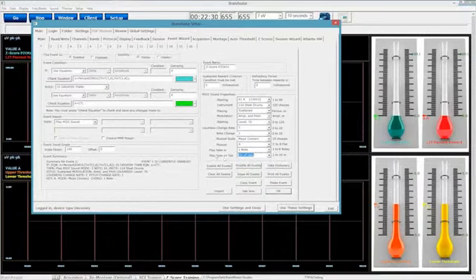Now, I'm not the best really when it comes down to getting sounds out here. There are a couple people out there who are excellent for this. Tom Brownback of Brownback Mason is remarkable with what sounds are best to choose, and Mark Smith is also very, very good at it. Another great person on that is Penny Jean Rudder, and so is Dick Gennardi. They're really good. What I'm going to give you is the very nitty-gritty out of it, okay?